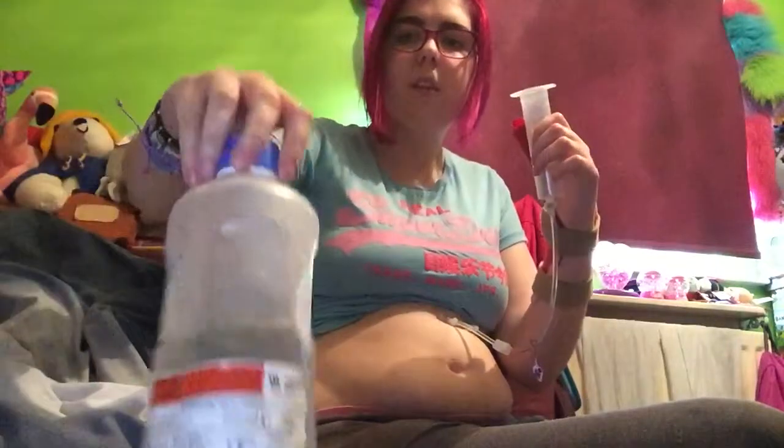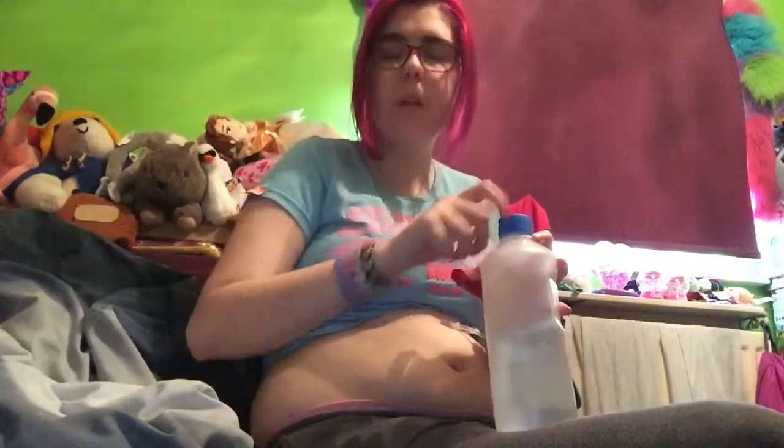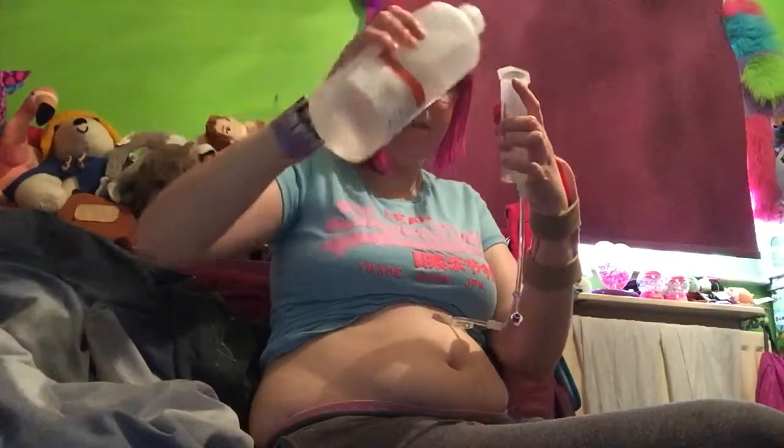So you're going to take some sterile water, and I am just going to give a 20 ml flush. There are two ways of flushing a PEG. You can either do a push or you can do it by gravity, and I'm doing it with gravity, but I will show you how to do a push as well. So I'm just going to measure 20. It's just a little over 20. It's 30, but that's what it will look like. And now I'm going to unclamp, and this will go in.